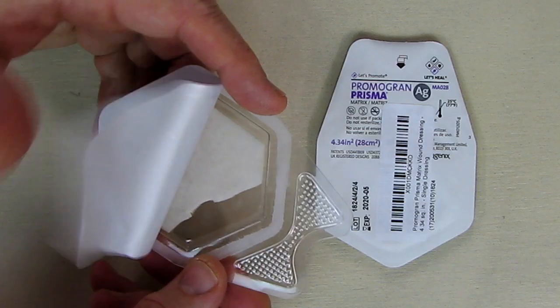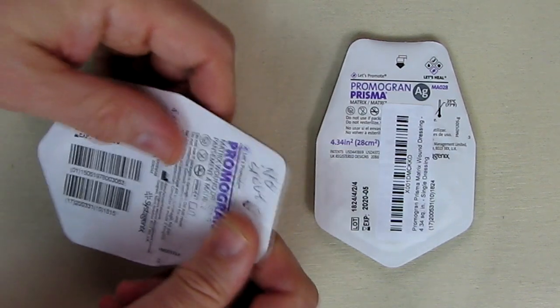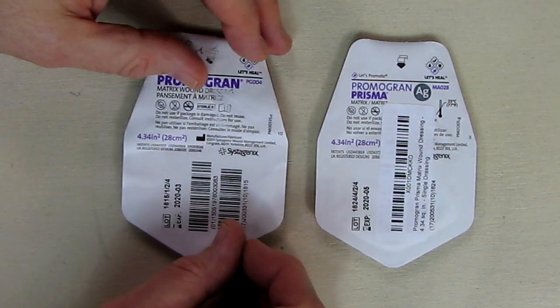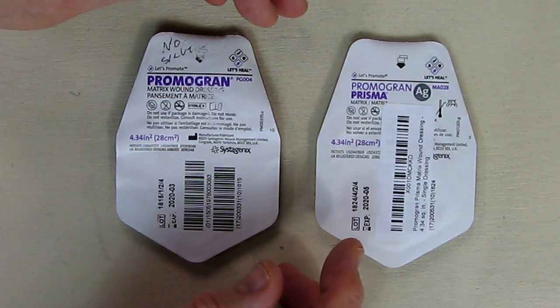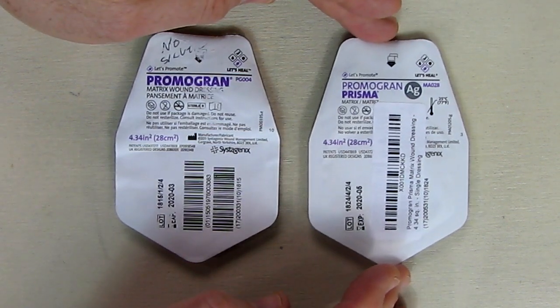What this will do is absorb into that wound in about a two-hour time frame. You'll see it kind of disappear — it melts away and adds collagen to that wound bed. And what that's going to do is help you form new matrixing in the wound to help it heal. That's pretty much why they call it matrix wound dressing.